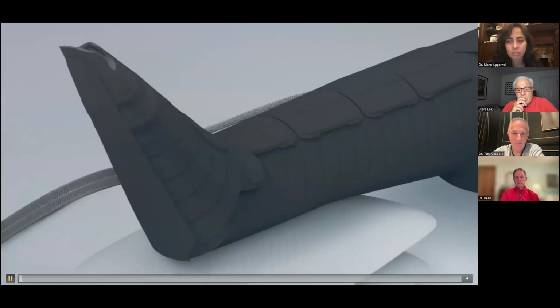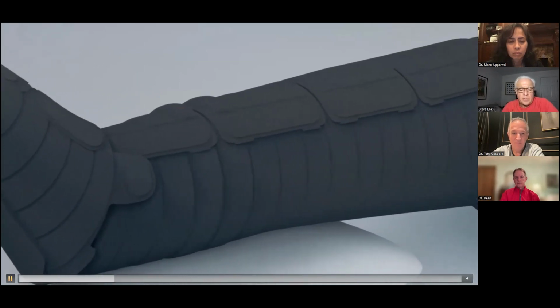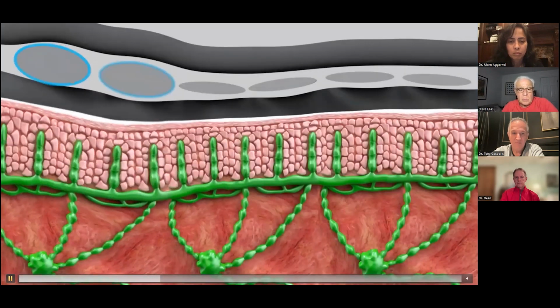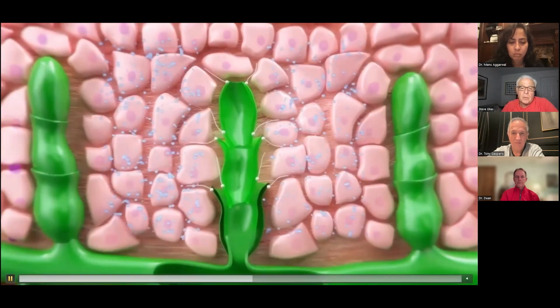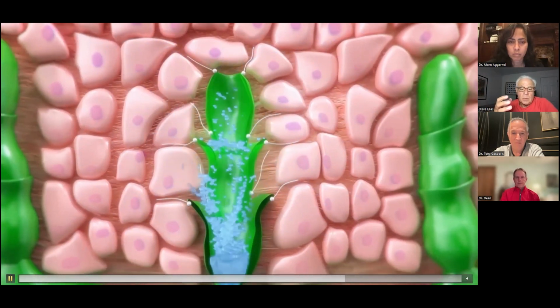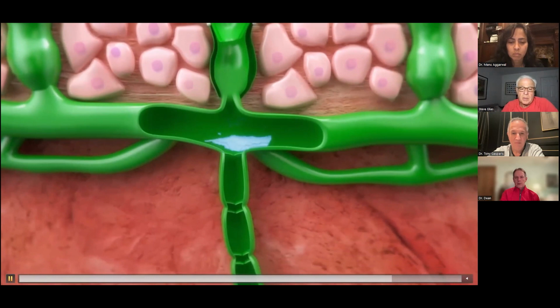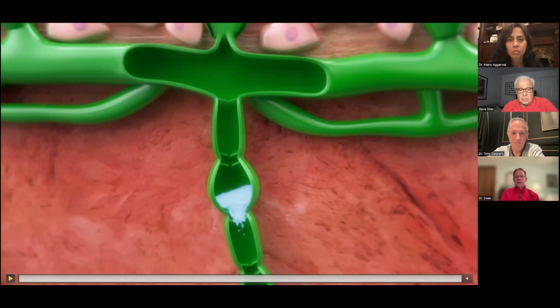Here you can see how it's working. Each chamber is inflating and then deflating for 1 to 3 seconds. It is inflate, deflate, inflate, deflate. So it's gentler, really mimicking manual lymphatic drainage more. Patients find it a little more comfortable because they're not having something squeezing on their leg for a longer period of time, and it allows for mobilization of the lymph fluid. As opposed to the squeeze and hold, this is referred to as a work and release technique. It's helping to move things, and it's more comfortable for many patients.